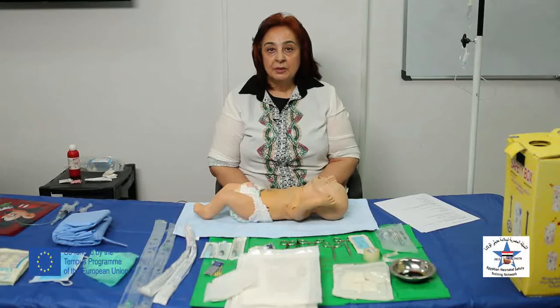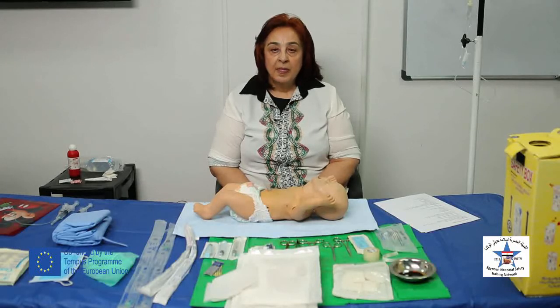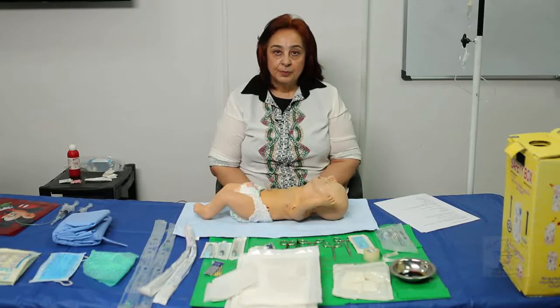Dr. Nagwa Hamdi, consultant of neonatology at Al Jalaa Teaching Hospital, following the general organization of teaching hospitals and institutes. Today, we are going to demonstrate umbilical catheterization, both venous and arterial umbilical catheterization.